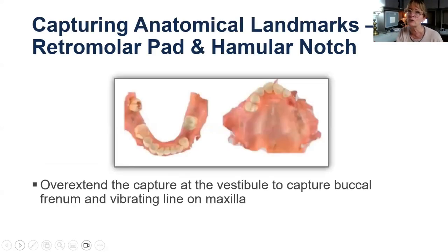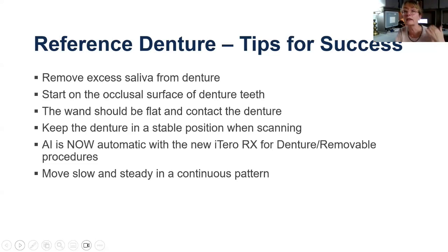And then when scanning intraorally, let me go back a second. When scanning intraorally, also, you want to make sure that you take a 2x2 gauze and wipe off the gingival tissue well before starting to scan. Now, typically, in my experience, the more geriatric patient, sort of myself included, once we start to lose the elasticity in our lips and cheeks, it's actually easier in my experience to scan those patients. It's the patients that have the real tight lips or very heavy cheeks can be a little more challenging to scan. And sometimes we need to walk them through the process as to what we're doing next.